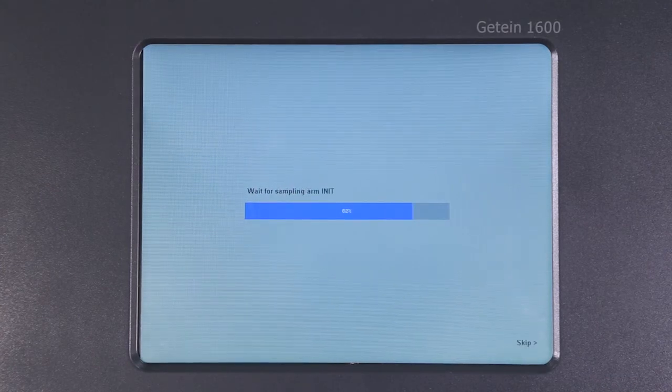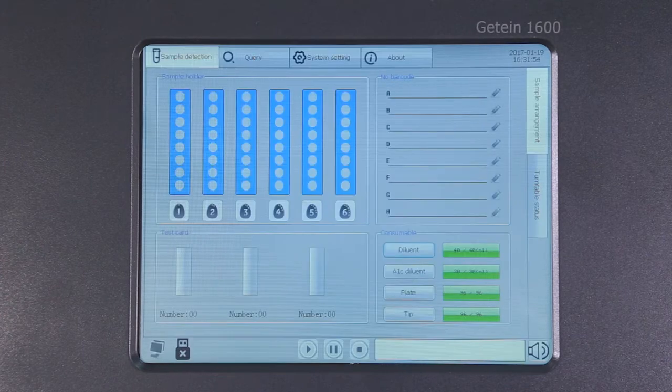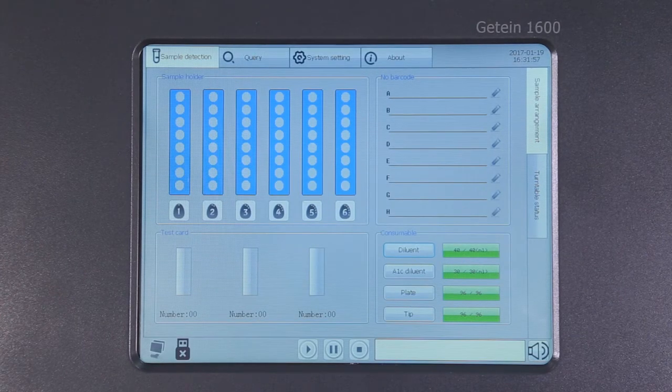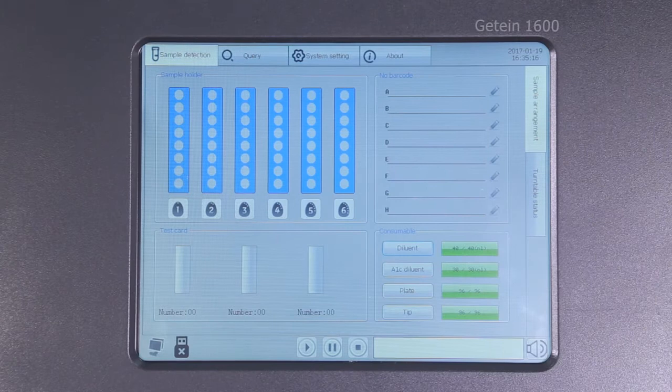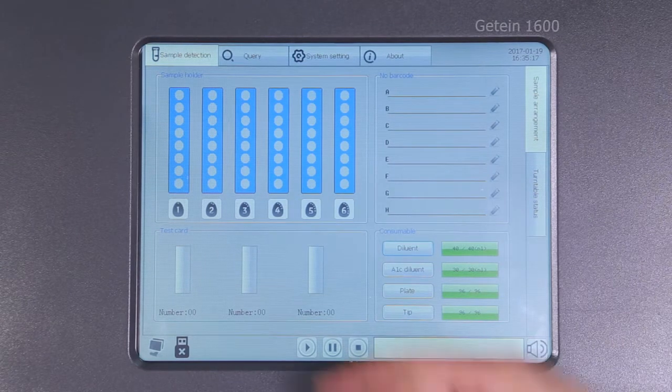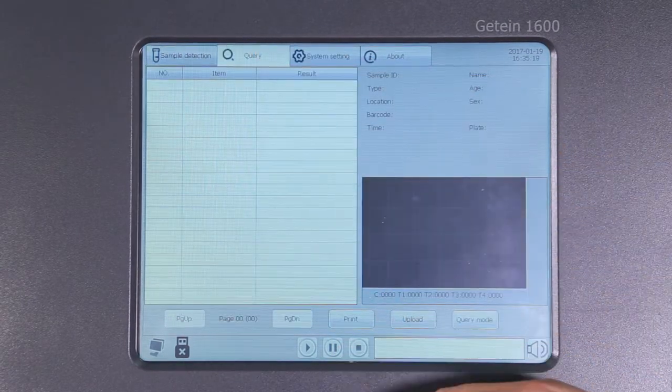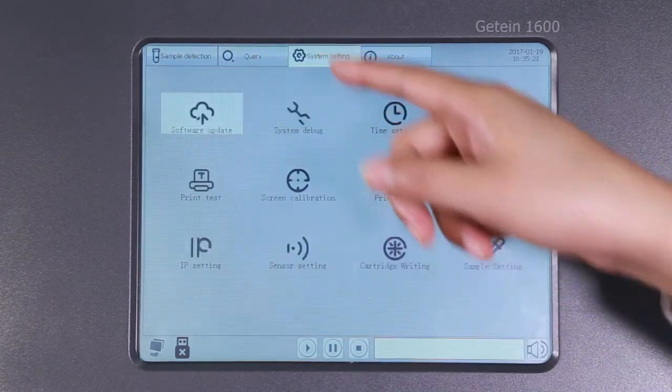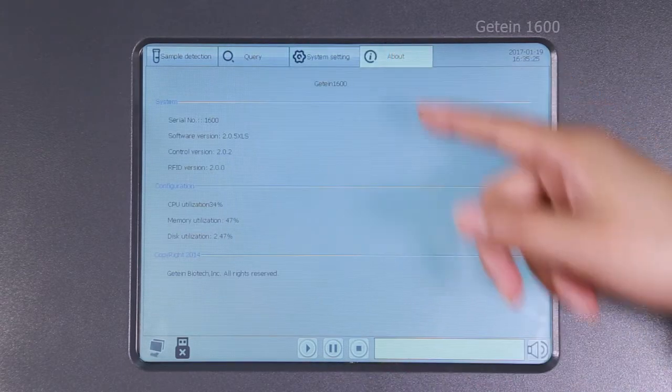Main interface will display after one minute self-check. On top of the main interface shows the following labels: sample detection, query, system setting, and about.